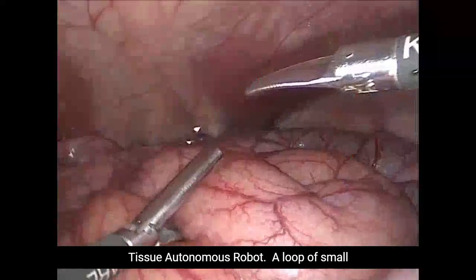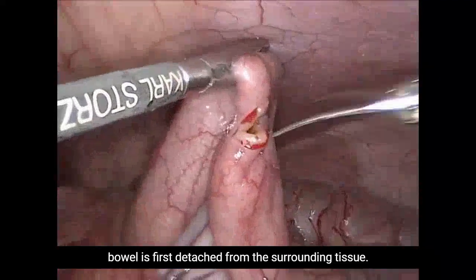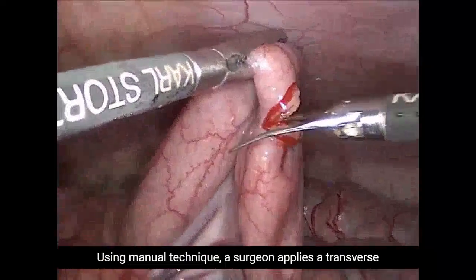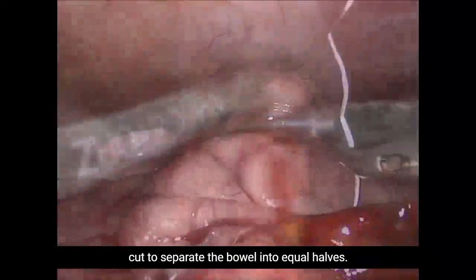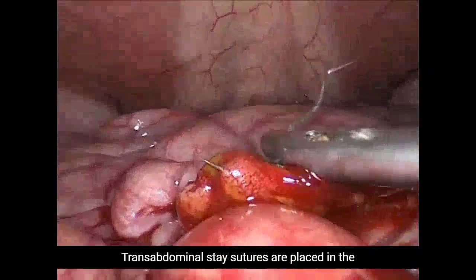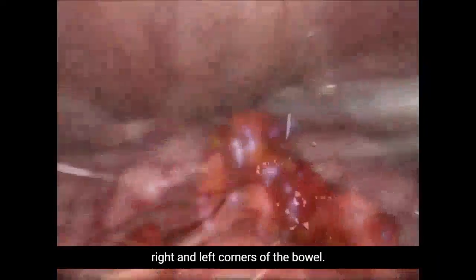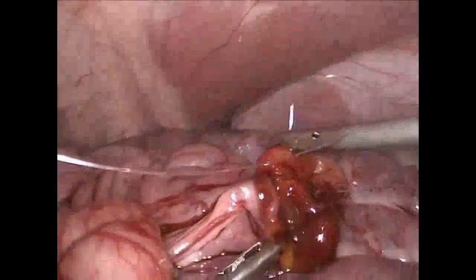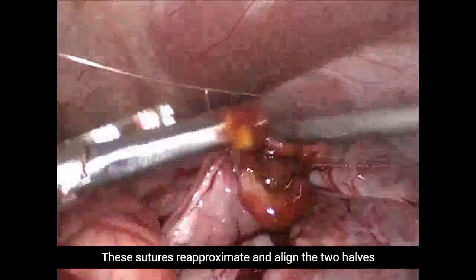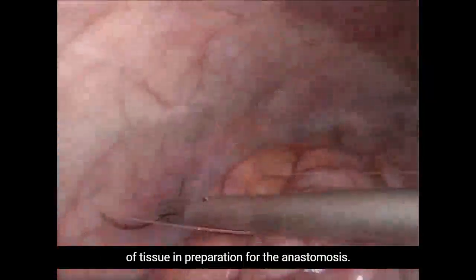A loop of small bowel is first detached from the surrounding tissue. Using manual technique, a surgeon applies a transverse cut to separate the bowel into equal halves. Transabdominal stay sutures are placed in the right and left corners of the bowel. These sutures re-approximate and align the two halves of tissue in preparation for the anastomosis.